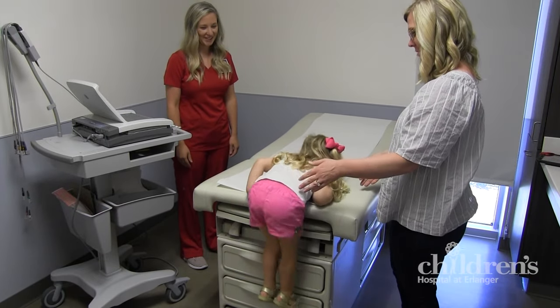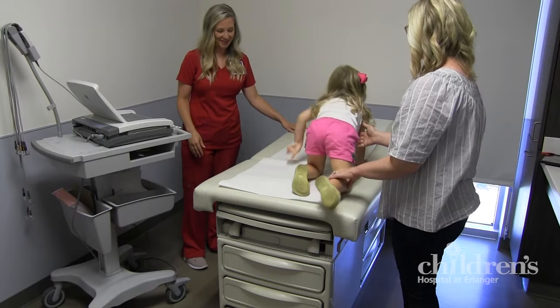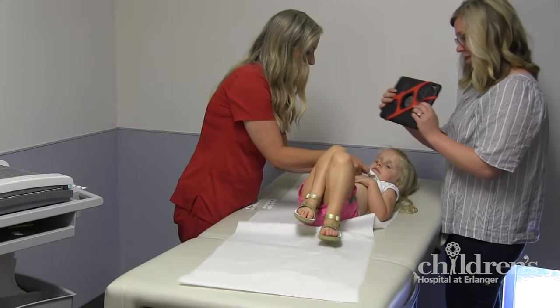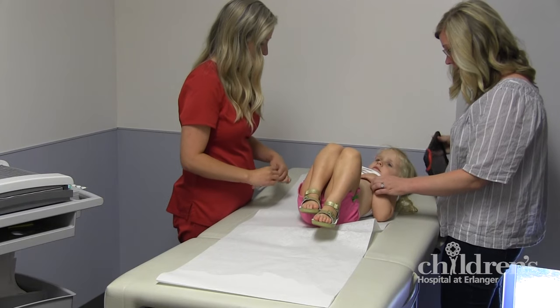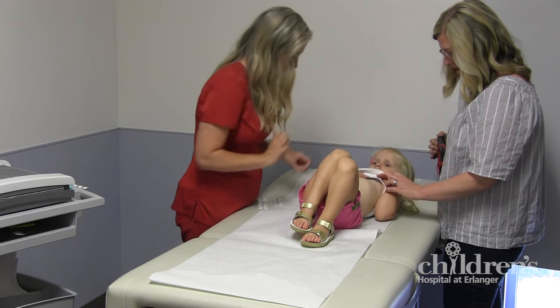First, you will lie down comfortably on our examination table. You'll need to stay very, very still so that the test will work well. Our technician will then put small stickers on your chest, arms, and legs. These are called electrodes.